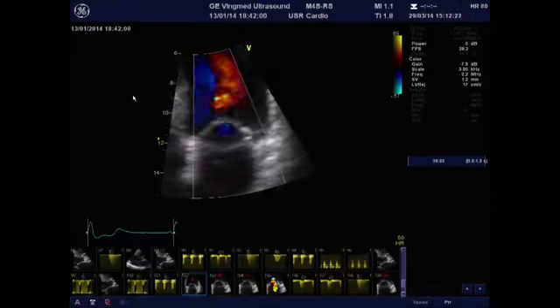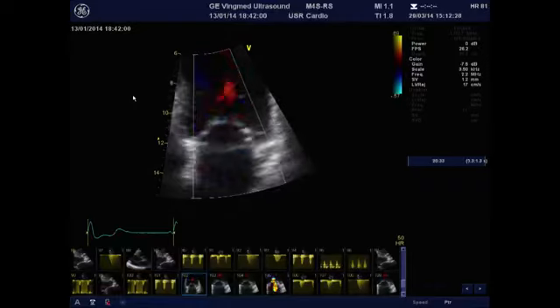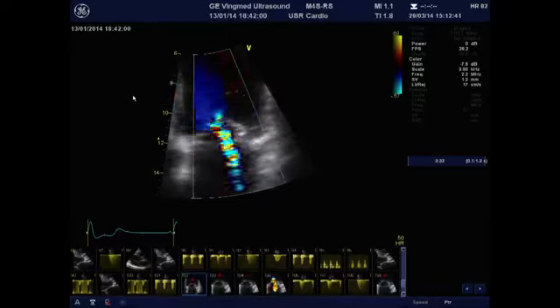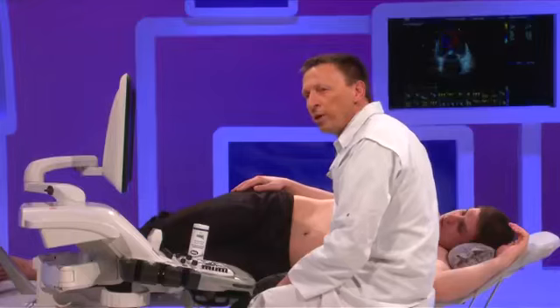The measurement of the effective regurgitant orifice by the PISA method is probably one of the best methods to use because it is less load dependent, and it has been shown to be less dependent on aortic valve replacement, meaning that after aortic valve replacement, the effective orifice area changes less than other, more load dependent parameters, such as the color planimetry or the regurgitant volume.